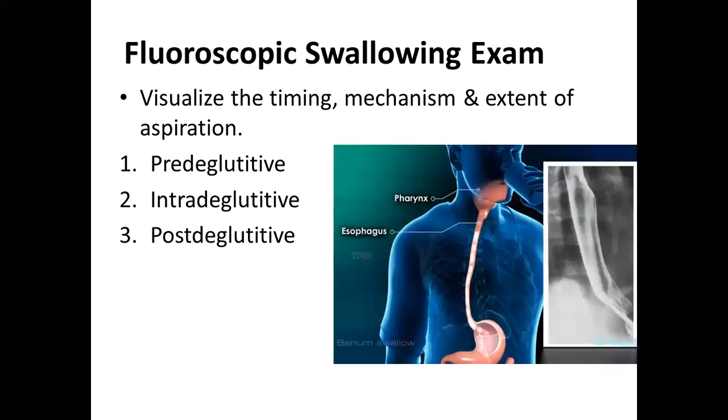So this is just a demonstration of how swallowing examinations are done. This is the contrast media in this cup, and the patient puts the contrast media into the mouth, and the tongue does its work and propels the contrast into the esophagus, going down to the stomach. So this is a normal barium swallow or contrast swallow with a well-outlined esophagus from the level of the aortic arch to the gastroesophageal sphincter around here.